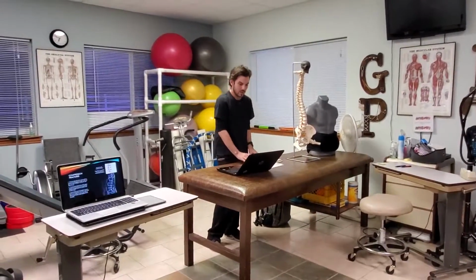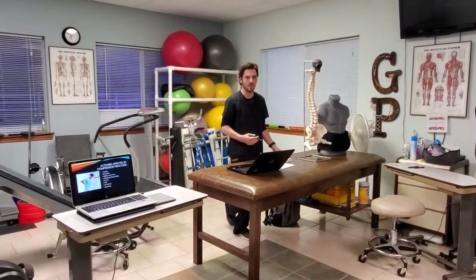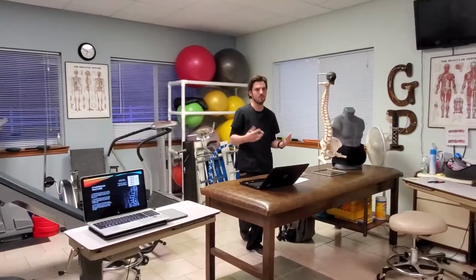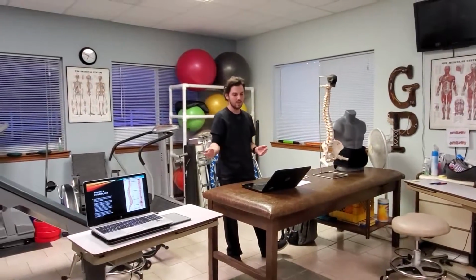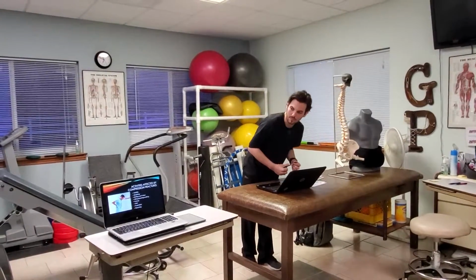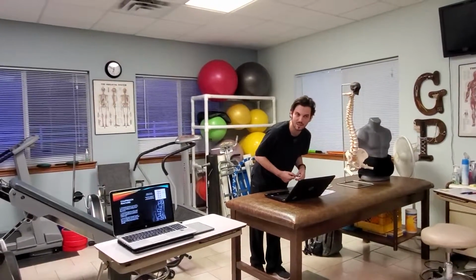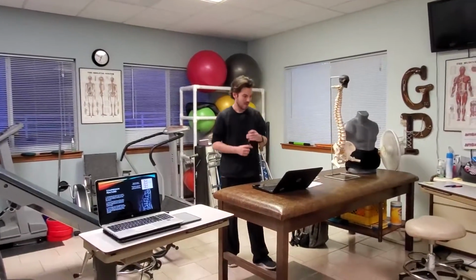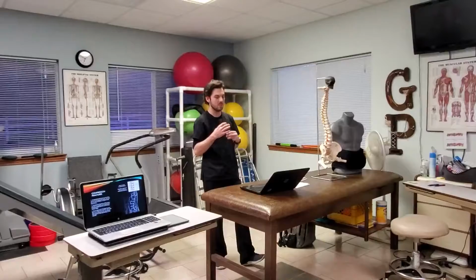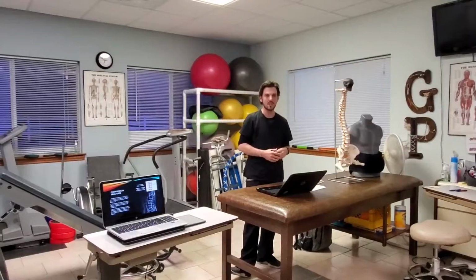A compression fracture occurs when any sort of force, blunt force or traumatic force, is placed on the spinal column, anywhere that could cause a fracture. As you can see right here on the PowerPoint, there is an X-ray image of what it looks like, I hope. Yes. Okay, so in this image you'll see what a compression fracture looks like on the vertebrae. In the MRI imaging, you'll see that this compression fracture is on T12.